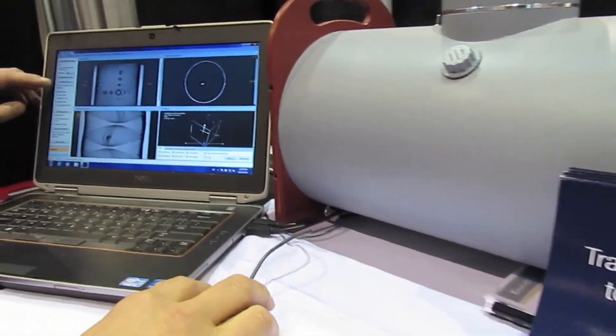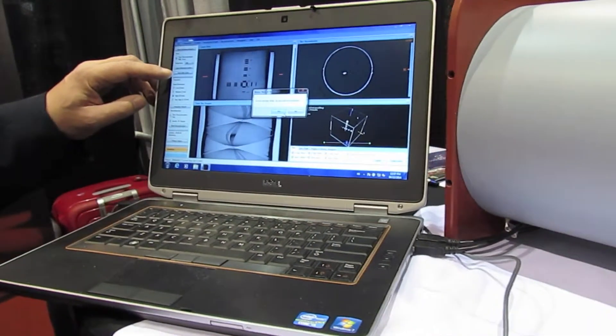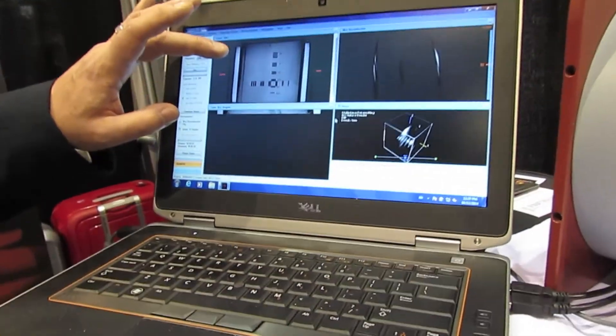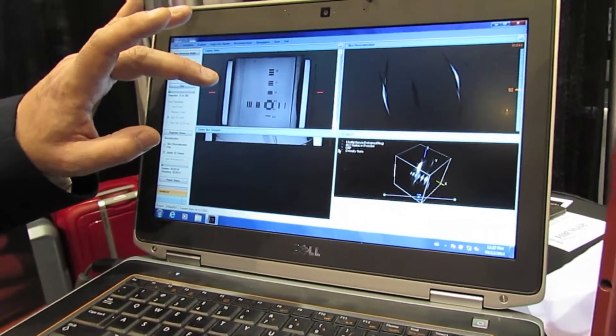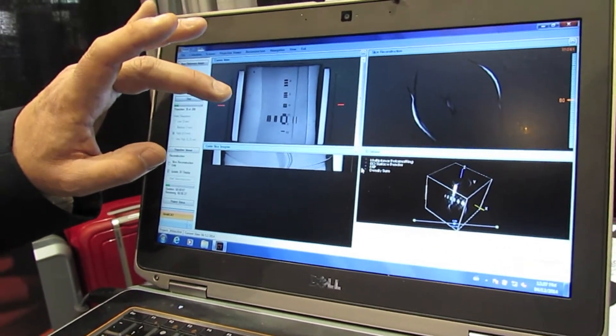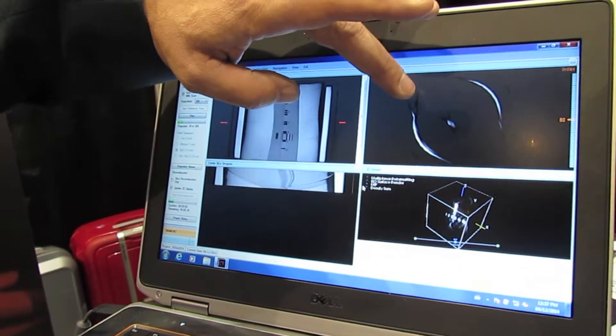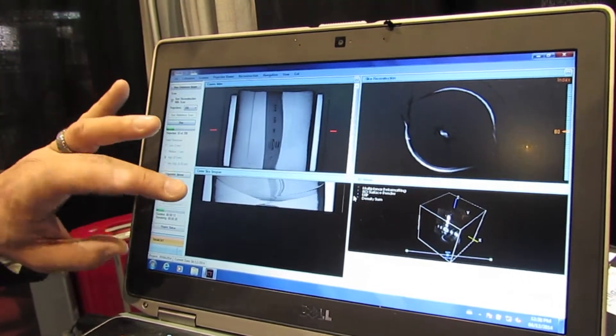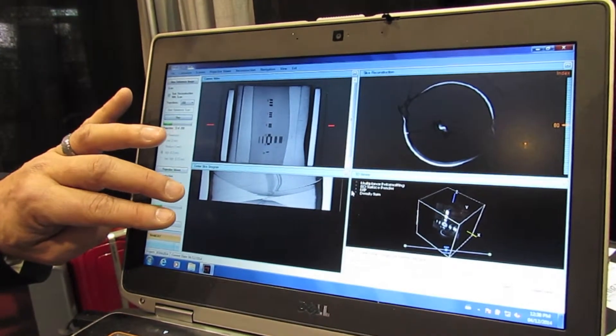I'm just going to start a scan now, so I'll start a data scan and replace the one that's already in memory. You can see in the top left corner here — this is a line pair phantom. The phantom is being rotated during the scan. We have a center slice reconstruction, so that's the central slice in the CT scan, and we have the center slice sinogram here.